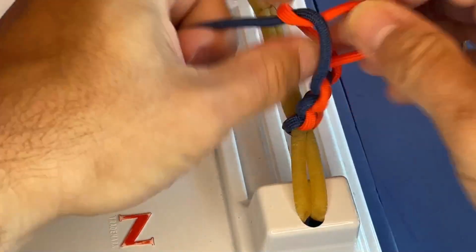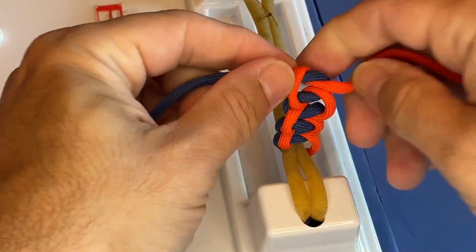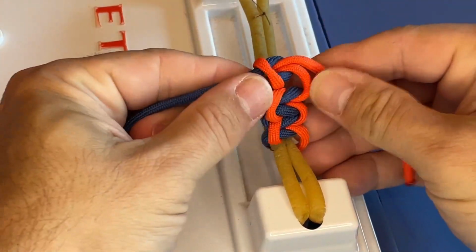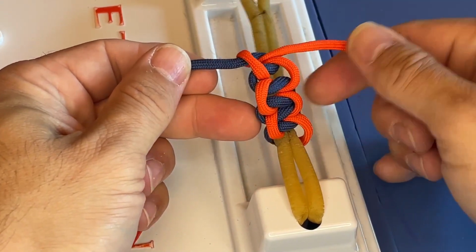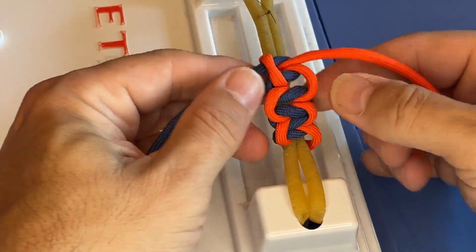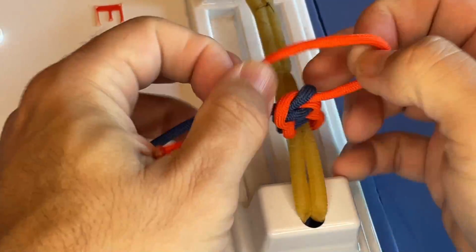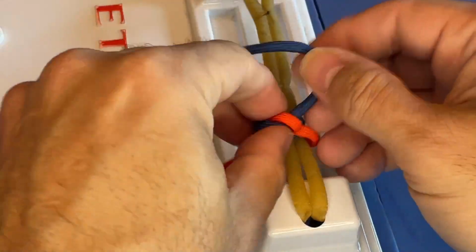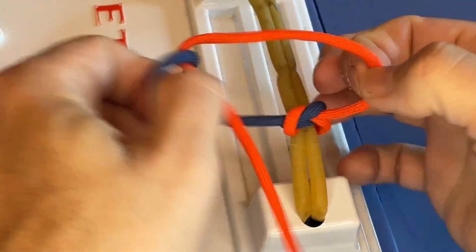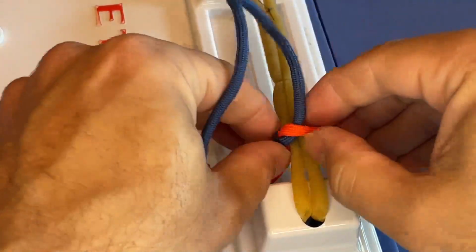You can do more here, over thumb, over finger, and just continue to lay down. You can see that those are nice, symmetric. We've got, again, kind of the loops and the 2 strands going through. So practicing with a two-tone, 2-colored, this is just a piece of nylon, small piece of nylon rope, like a heavy shoestring that I got and dyed the 2 colors.